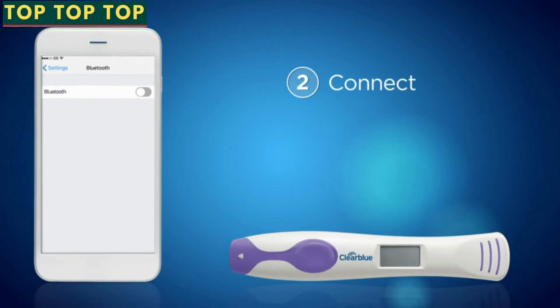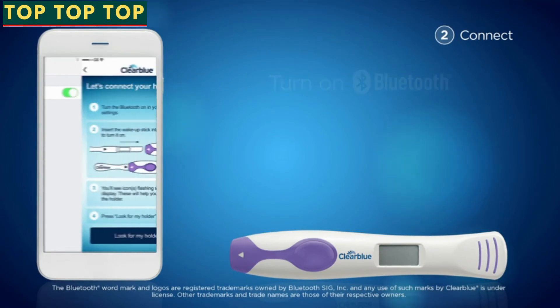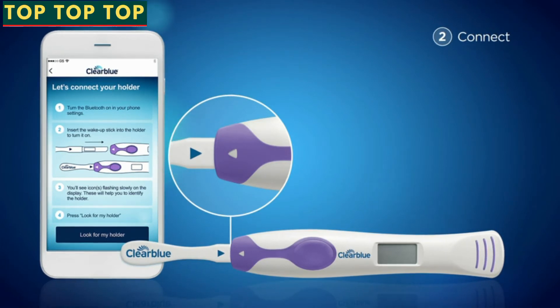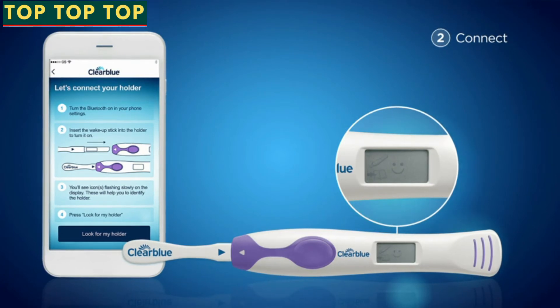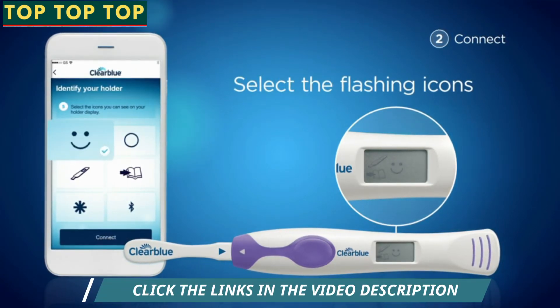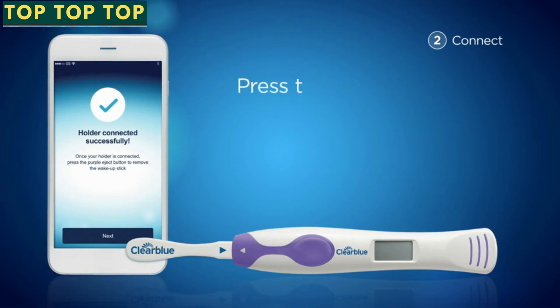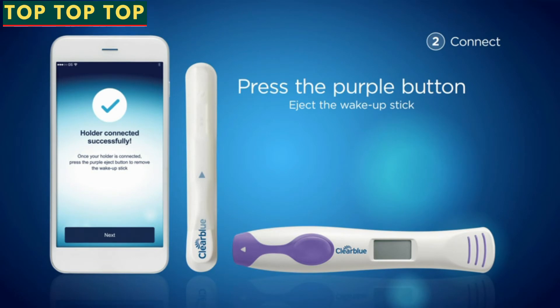Please check your spam folder if you can't find it. Step 2: Connect the system. Make sure Bluetooth is turned on on your phone. Insert the wake-up stick into the holder until you hear a click sound and follow the on-screen instructions. A set of flashing icons will appear on the display. Press 'Look for My Holder' to connect the system. Select on your phone the icons matching those on the display. The holder is connected successfully. Press the purple button to eject the wake-up stick. Please keep it, as you will need it again.